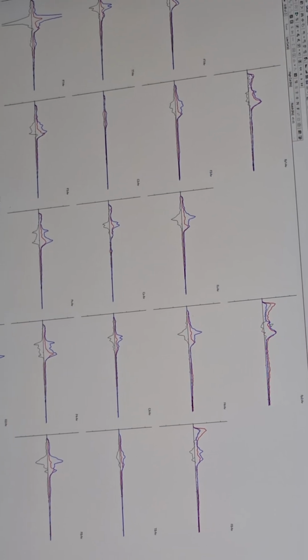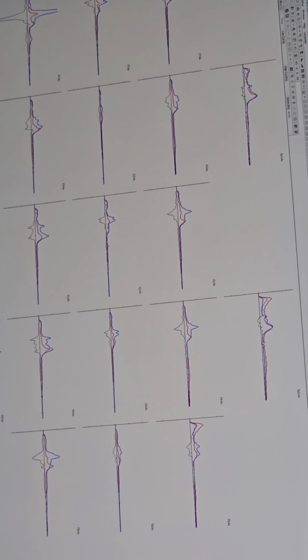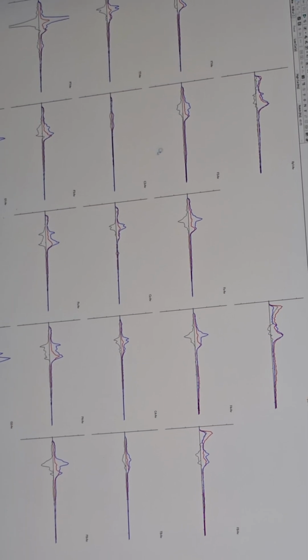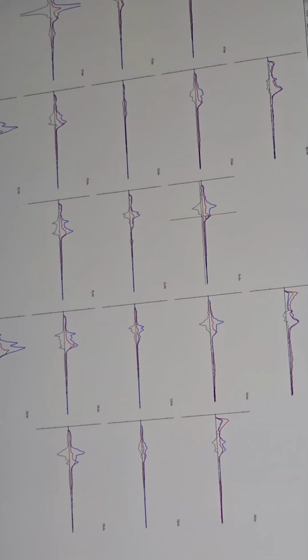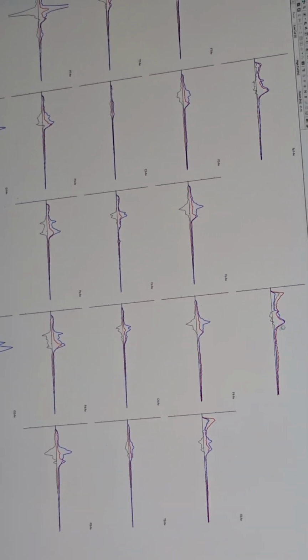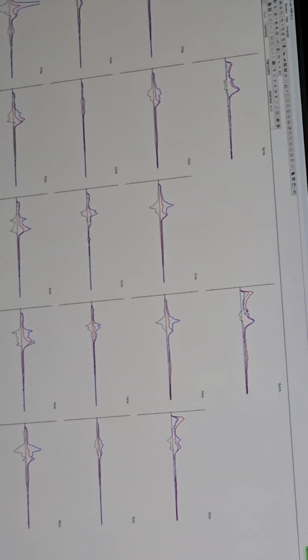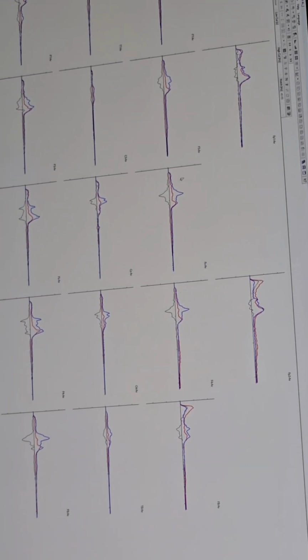That's actually really interesting. The frontal poles haven't really changed, right? See, the blue and the red are about the same. Blue is before, red is after. So at FZ, it's changed significantly, but up here it hasn't. I mean, it might still.